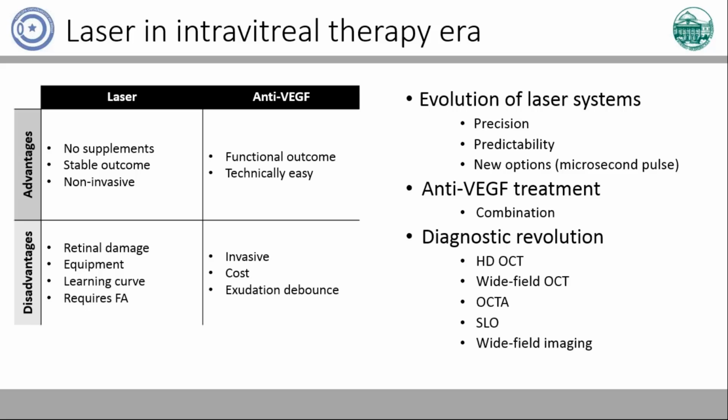And the third, maybe the most important thing to remember, is that today we have a diagnostic revolution, which gives us many diagnostic modalities that we never had before. It is high definition OCT, different wide field options, OCTA, scanning laser ophthalmoscopy. All these modalities facilitate our laser treatment and give us better and better outcomes.